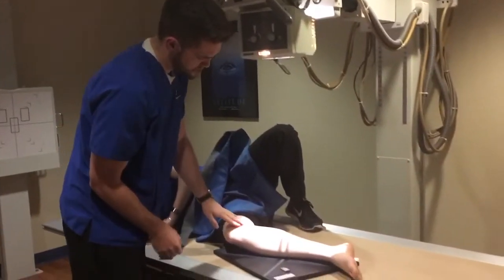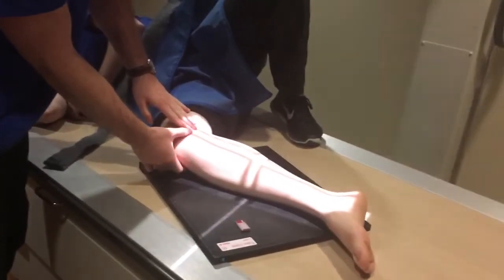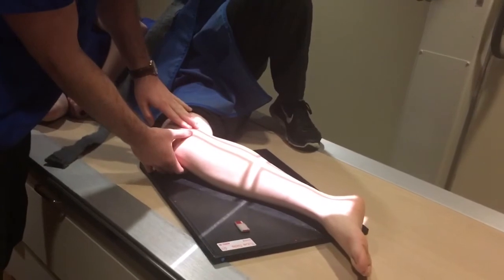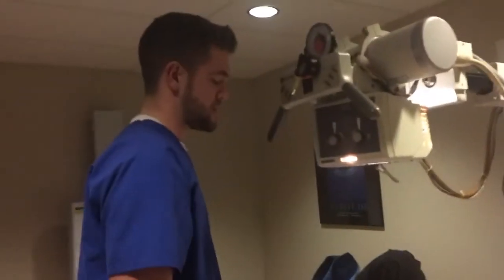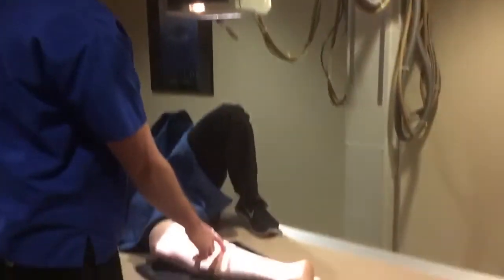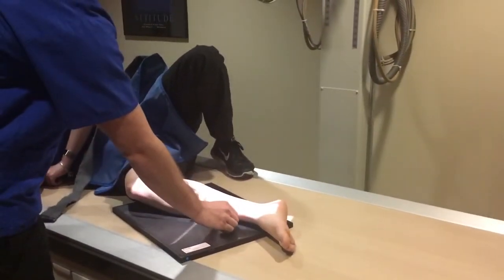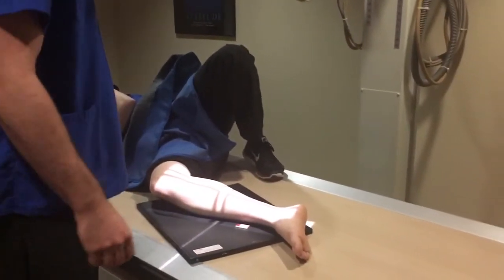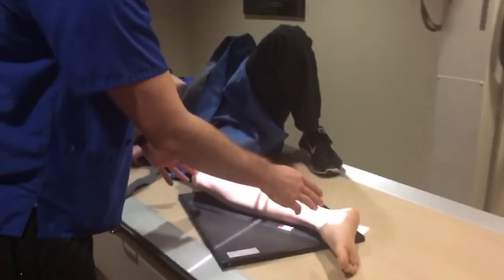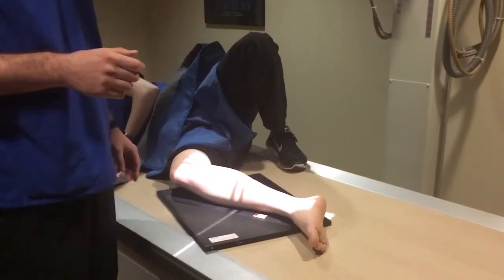To check for rotation, you want to make sure that the epicondyles are on top of each other, perpendicular to the image receptor. The central ray is mid-lower leg once again. We're going to be using a right marker. Make sure that you're getting both joints on the image receptor, and collimate to include all soft tissue.